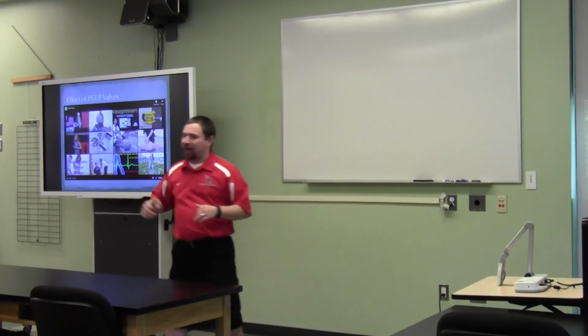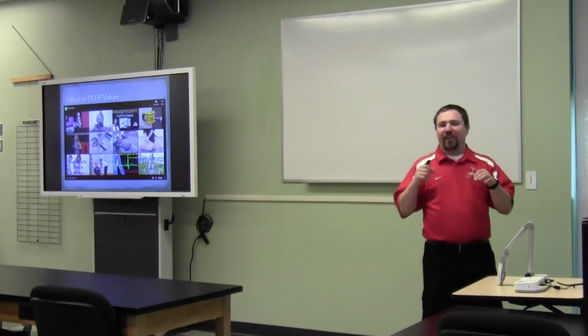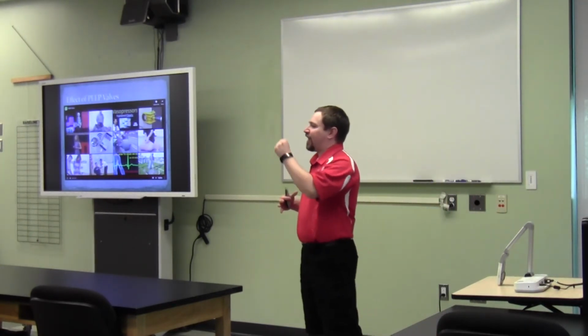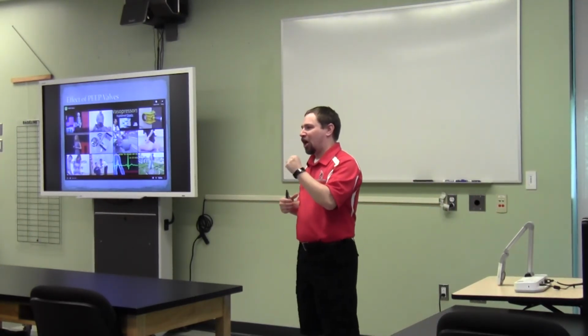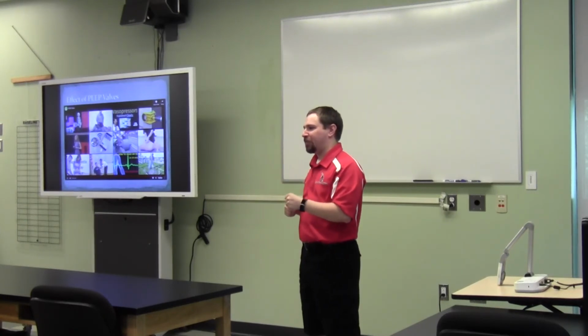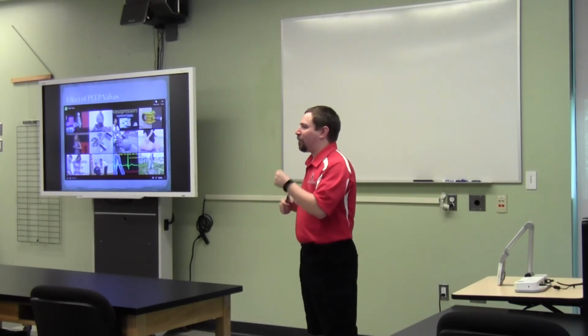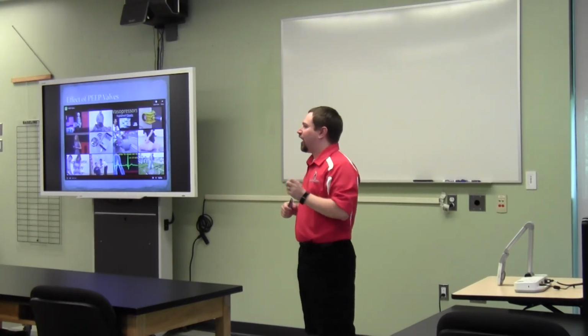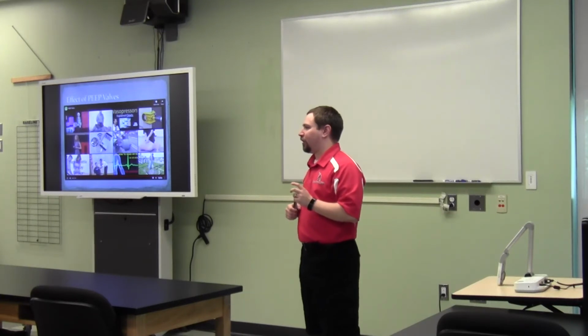Okay, so that was the big thing I wanted you to walk away with. But bag valve mask is something else I want you to feel comfortable with today, because it's a very effective way for us to help our patients with ventilation and oxygenation. But it's a skill that breaks down. We all touch it once every 2 years when we do our professional rescuer, and we never touch it again for the most part.